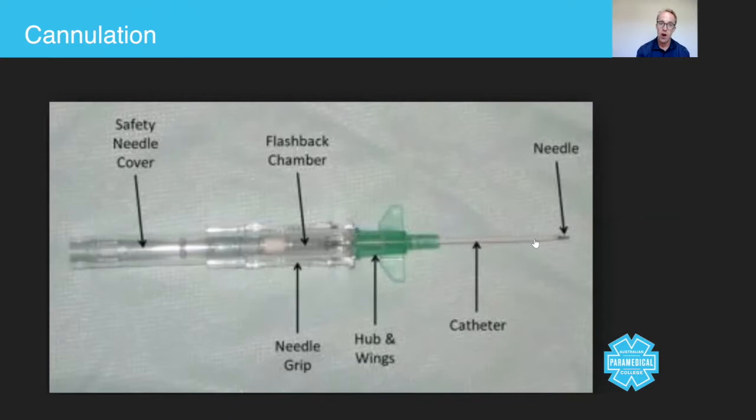When you pierce a patient's vein using the needle, the blood rushes up the catheter and into the flash chamber. That's one of the ways you recognize that you're in the right place, because blood will fill the flash chamber.